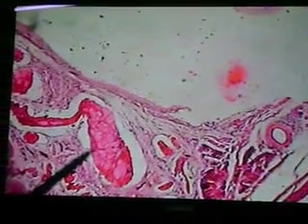So this is the subendocardial layer, or subendocardial connective tissue, right here. Very, very nice. You can actually see something emanating right from here. And the whole thing is now traveling down. Many years ago we actually found an SA node. So this is beautiful right here.